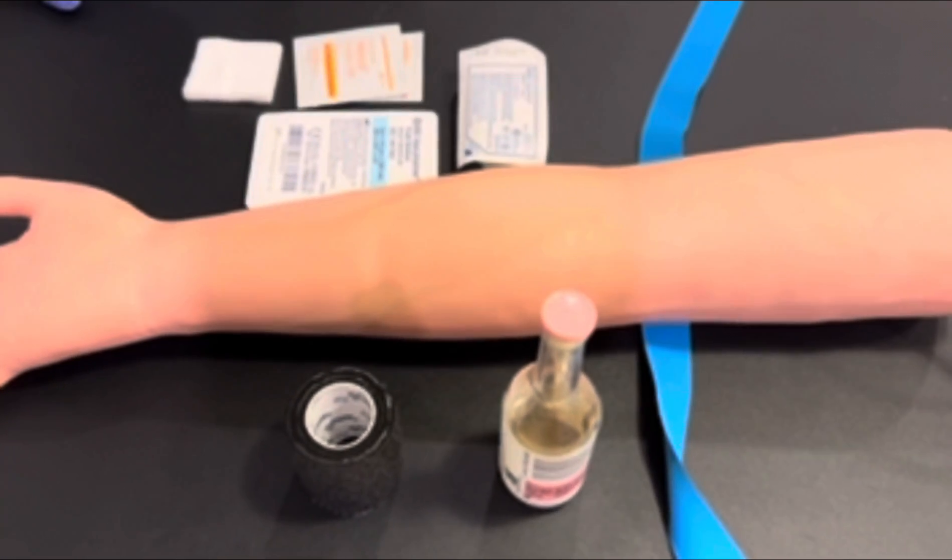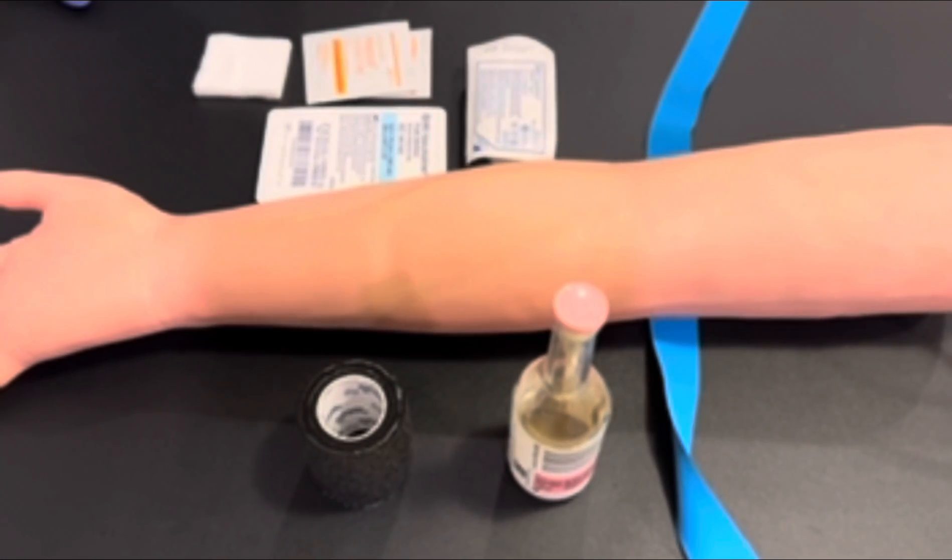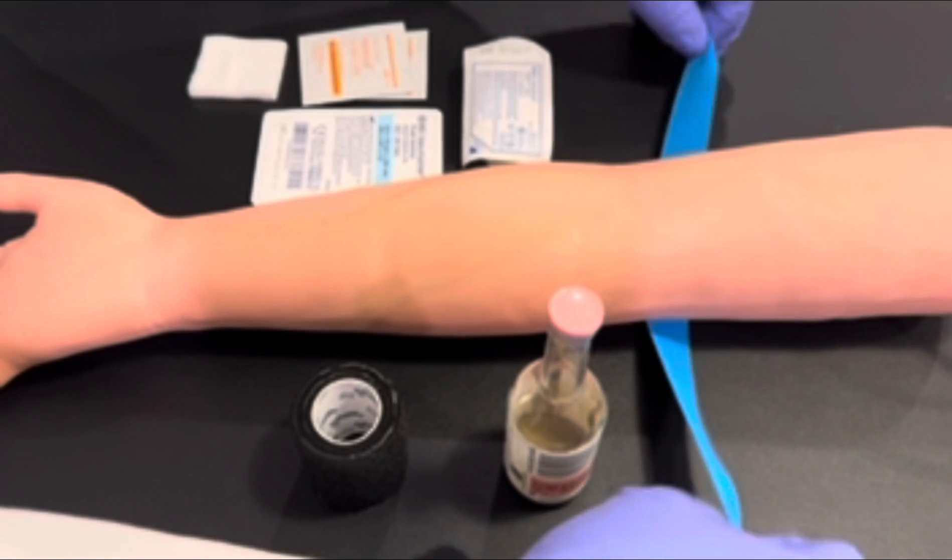Welcome back to another segment of Mastering Phlebotomy. Today we're going to perform a blood culture procedure.